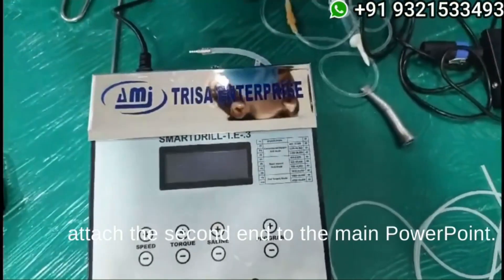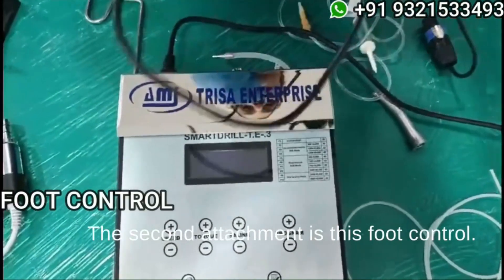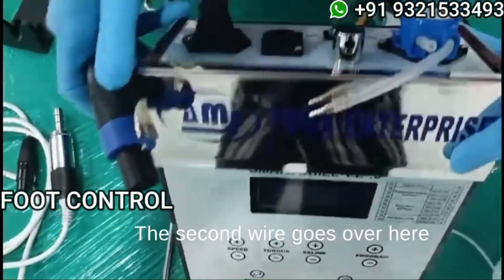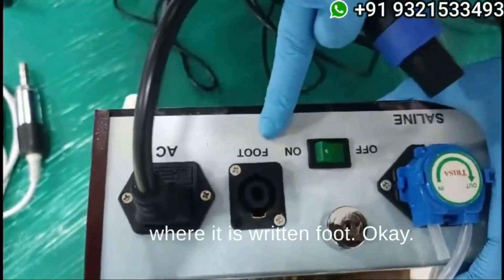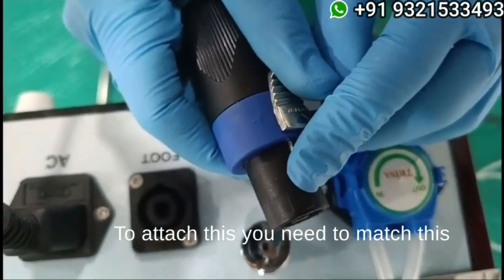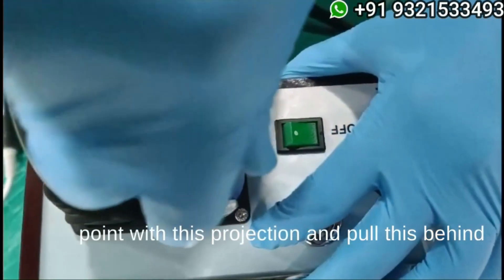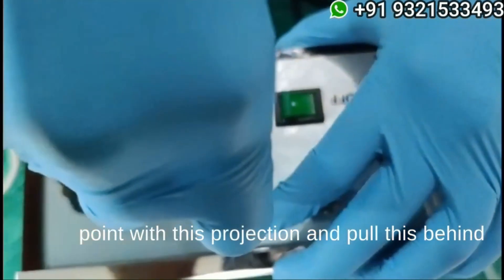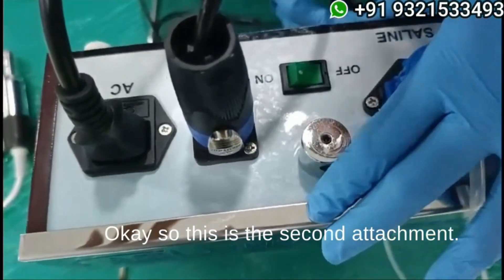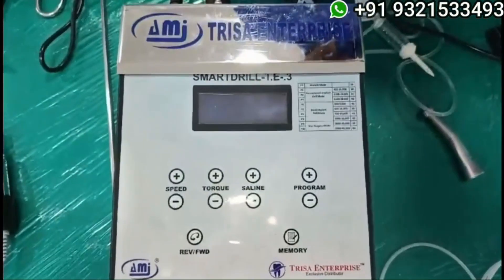Attach the second end to the main power point. The second attachment is the foot control. The second wire goes over here where it is written 'foot.' To attach this, you need to match this point with this projection, pull it behind, place it, and then turn it.